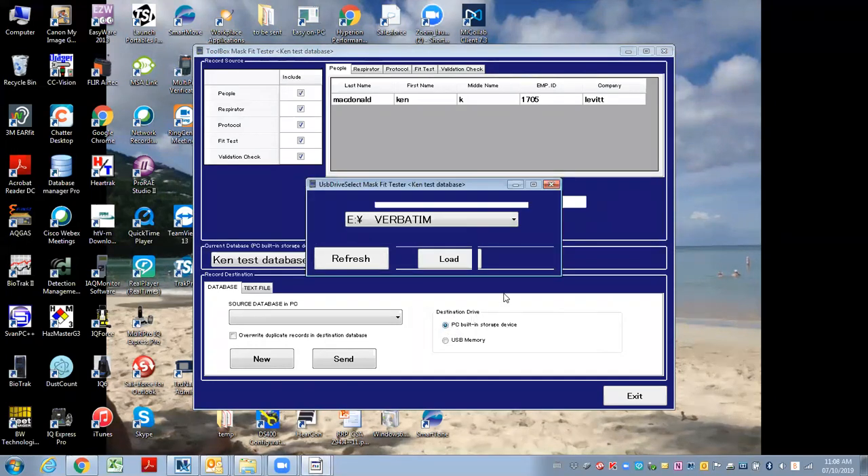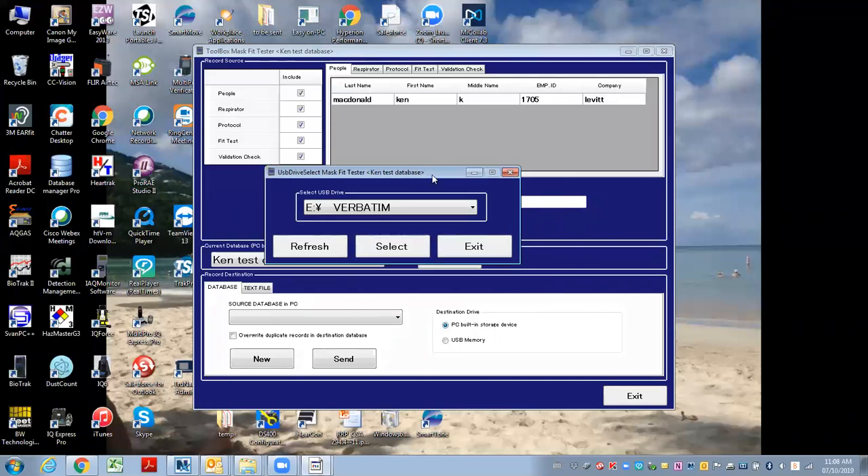Now it's asking me what data I want to import and what flash drive I want to pull from. I may have multiple ones attached, but I've only got this one. So I select it, click select, and hit exit.